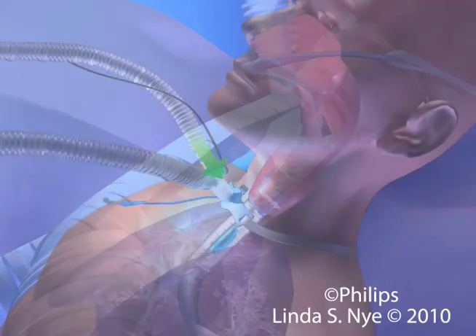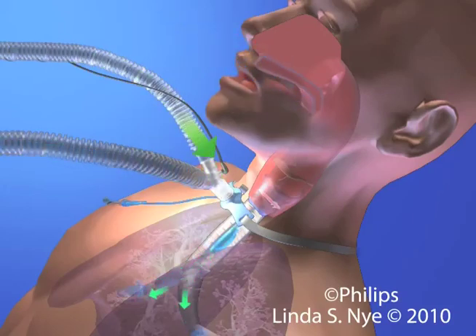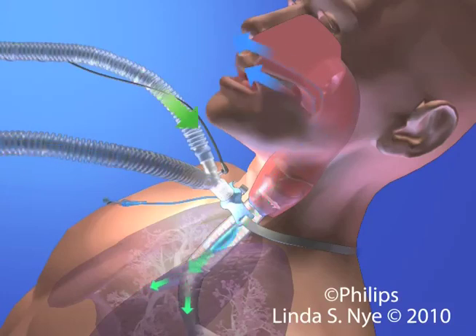Patients quickly learn how to coordinate their breathing to speak during the exhalation phase of mechanical ventilation. Speaking mode may be used in volume control, pressure control, or in assisted modes of ventilation, such as pressure support. For safety, the patient is always being monitored by the V200, and audible alarms will alert clinicians to any changes in the patient's ventilation.